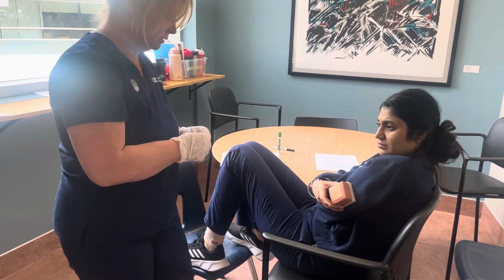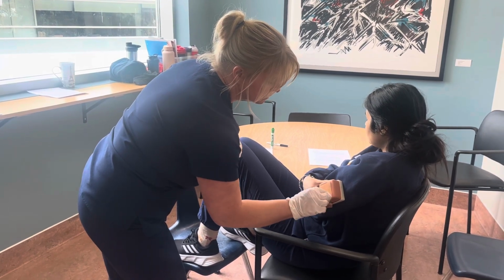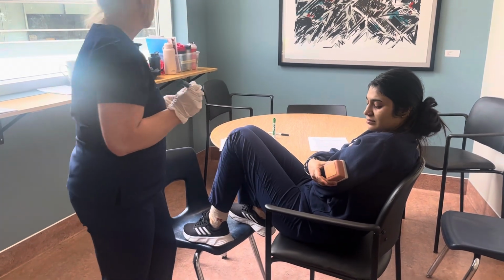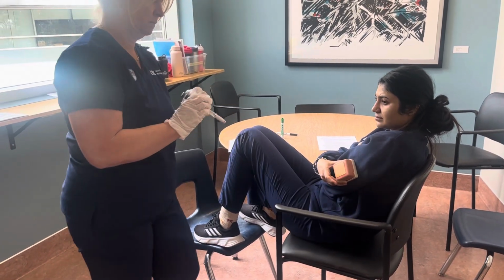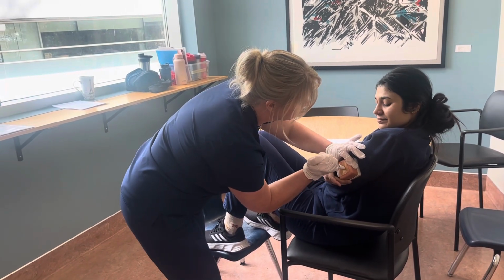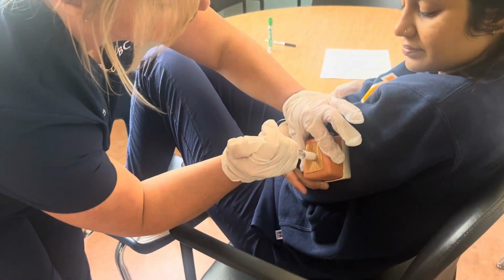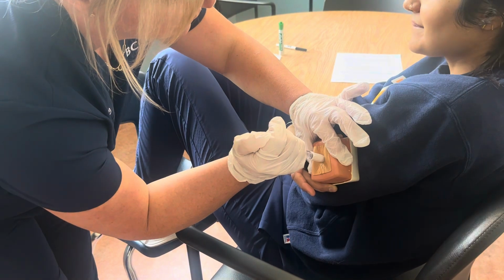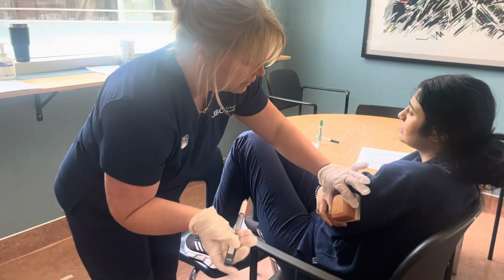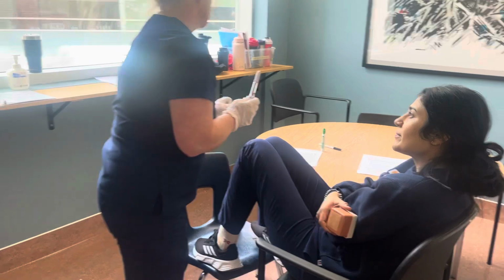Let's do a little swab here. So just moving in a circular direction. Take a little squeeze there. You can take a big deep breath. Just holding for a count of 10. Take out. And then I would assess the site to make sure that we don't have any leakage or anything, no bleeding, that kind of thing. Okay, and if there was any bleeding, we could just put a little tab on there.